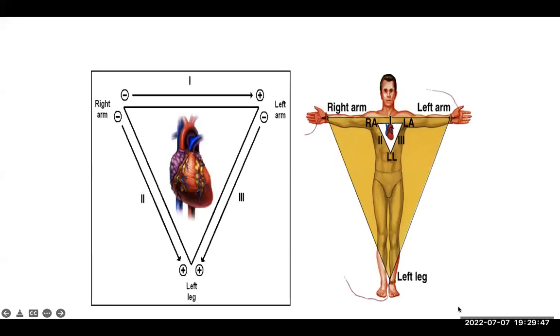So what I'll do is I quickly remind you, I suppose obviously your basics are good. So this is just a quick reminder. The first few slides is just a quick reminder. And thereafter we'll go through ACS, ischemia, because that's very important, ischemia and infarct. We'll look at chamber enlargements. We'll look at some arrhythmias. We'll look at bundle branch blocks, AV blocks, and potassium abnormalities, pericarditis and a paced rhythm. I think that will be more than enough. I'm not very sure if they will go outside that. And if you get the concept of these basic ones, I think the rest will be an add-on.